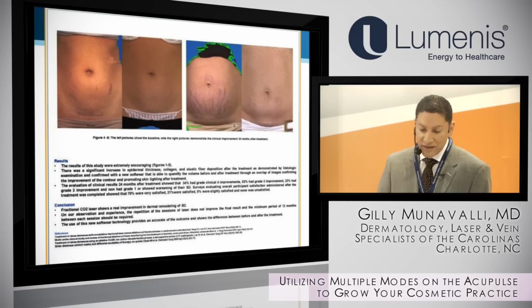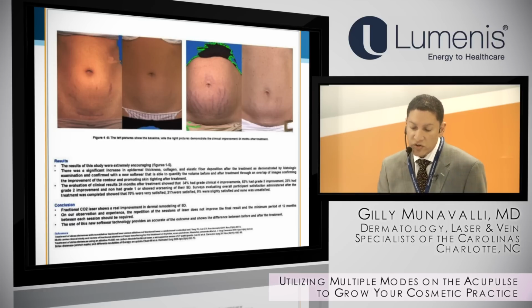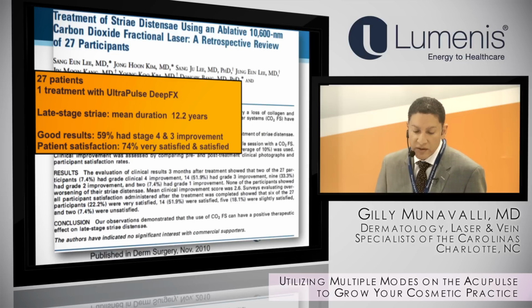Okay. And you can see here in his study, this is the kind of stretch marks we would target, probably starting with either the pulse dye or something to get rid of the red, and then following up with the narrow pattern and tracing out each of the stretch marks to get improvement. This was a really nice improvement. This is similar to what we've seen in some of the patients.